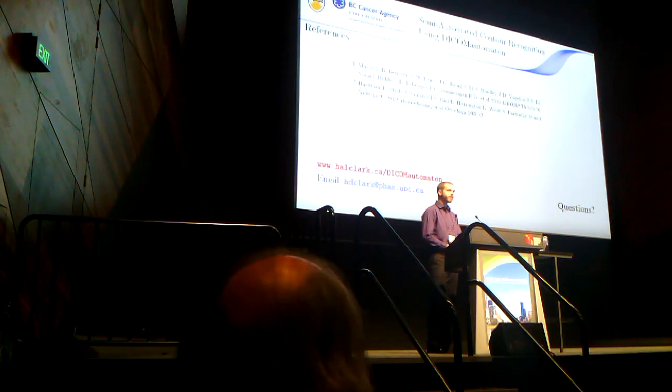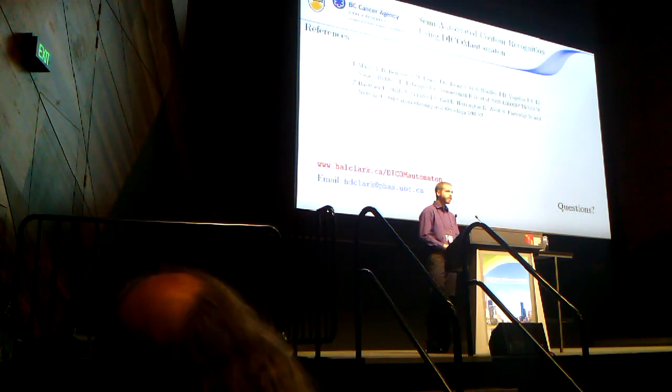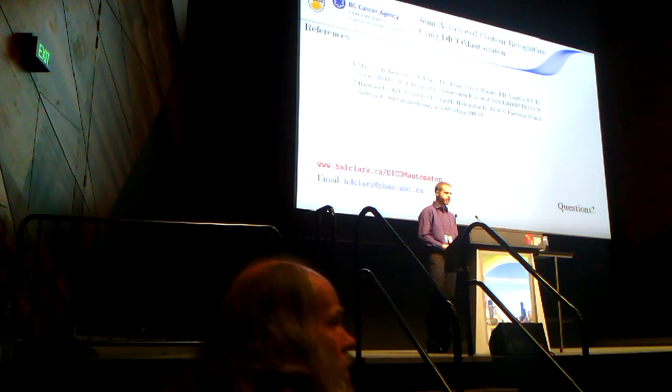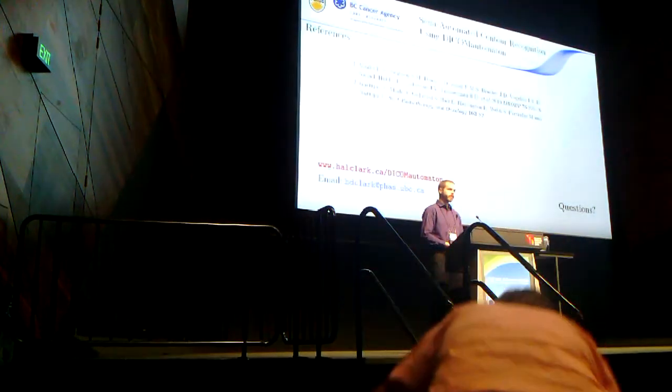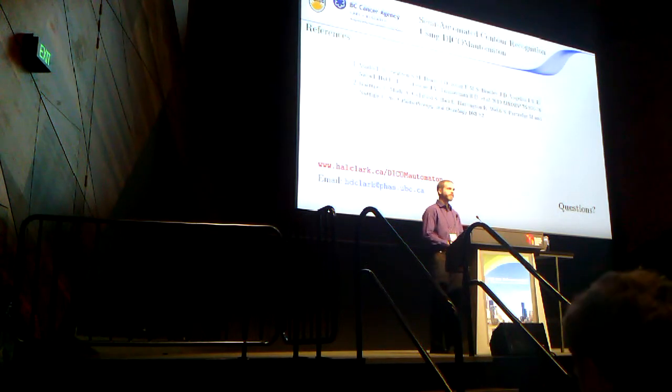That's pretty interesting. Does your program also record the probability, how likely it is that certain structures have been identified properly? Yes, absolutely. Just like a spell checker, we can go in and see manually or in real time the predictions and influence the future predictions. You might not make the geometrical thing sound easy, but how do you know that it's going to be in the head and neck or pelvis? Generally, head and neck and pelvis patients are segregated naturally. So in this case, we have a separate set of data for both, a separate lexicon for both, rather.